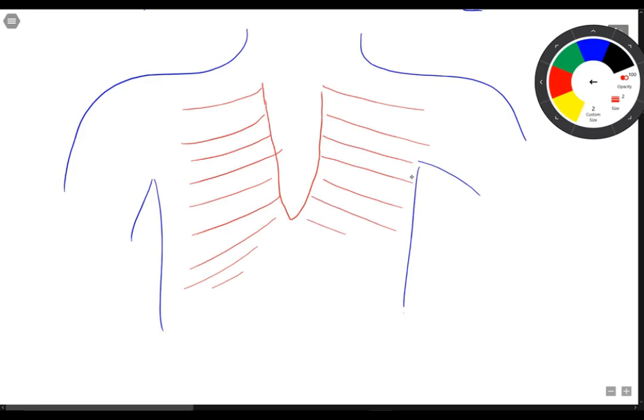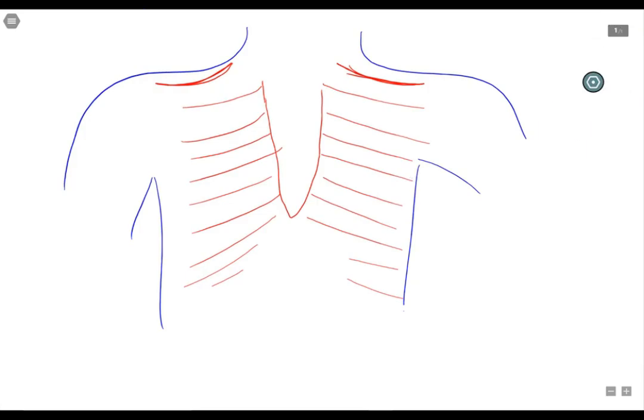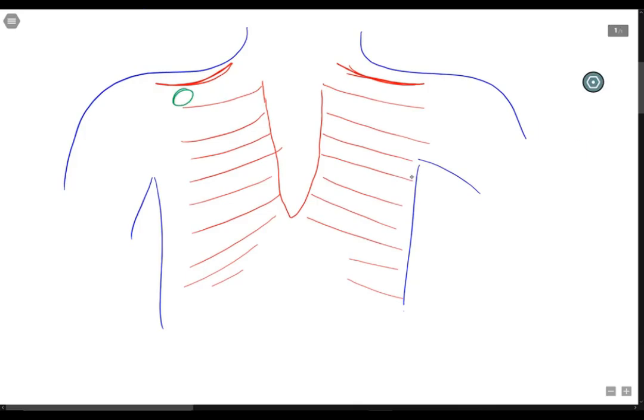Hopefully this works out well. And even their clavicle. We'll put a clavicle up here if we can. So this is just a very rough sketch. So we'll put the right arm electrode here, the left arm electrode here, the right leg, and the left leg.